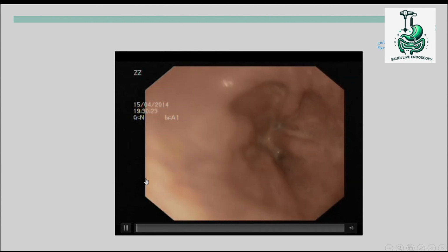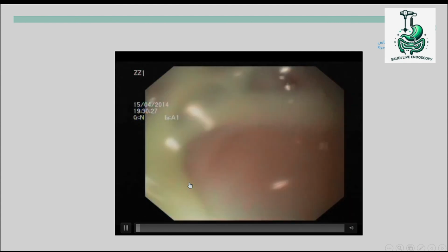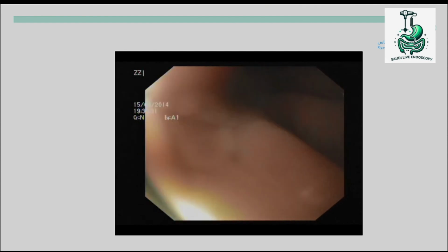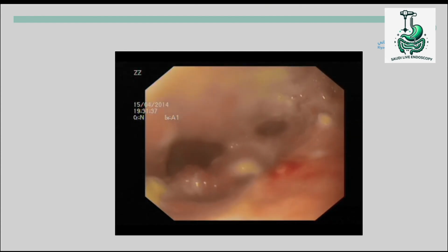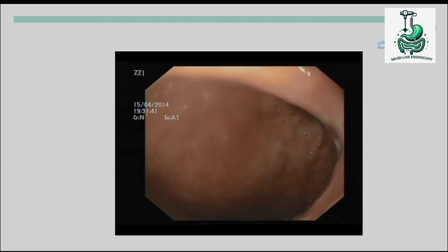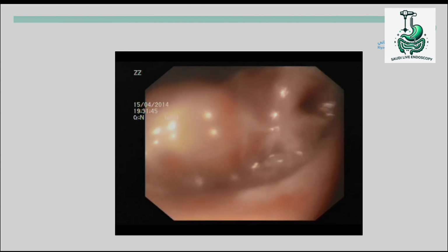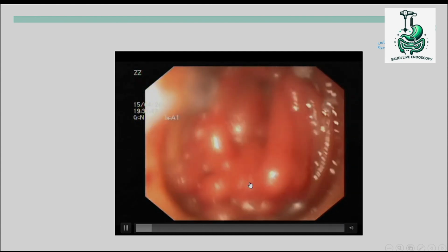This is one of the older videos, but I really like it because it shows you many things in bariatric endoscopy. This is a patient who had Roux-en-Y gastric bypass and presented with sepsis and a leak. He came to us about 2 weeks after the surgery. Here we're at the cardia. Just after we passed the cardia, we first imagined that this is the lumen or the gastric pouch, and then after closer assessment, we found that the lumen is actually down here. This is the jejunum where we enter now.